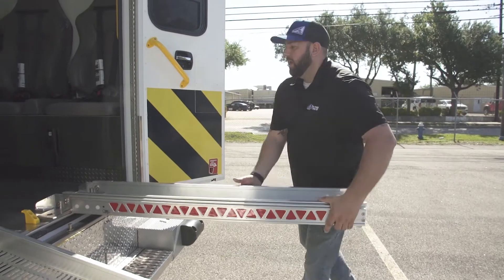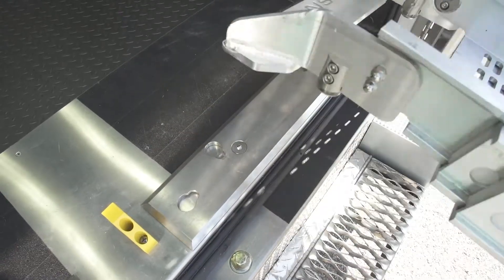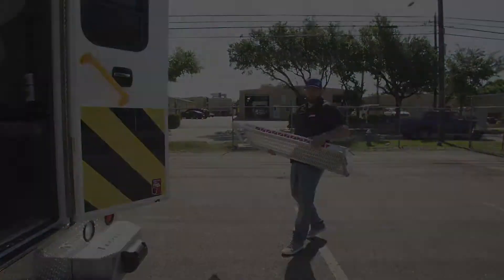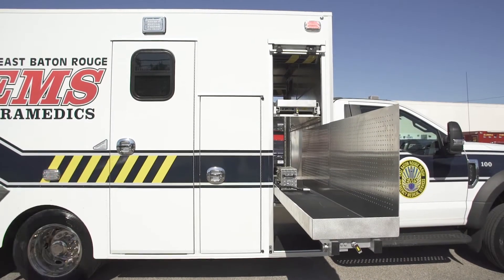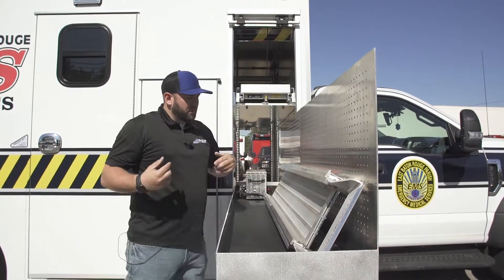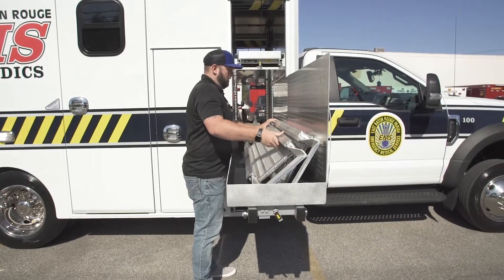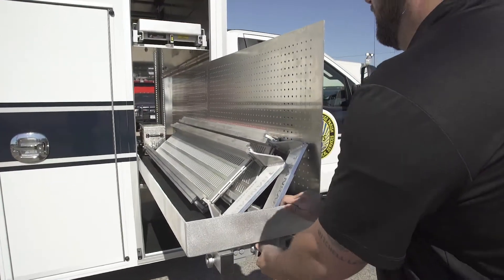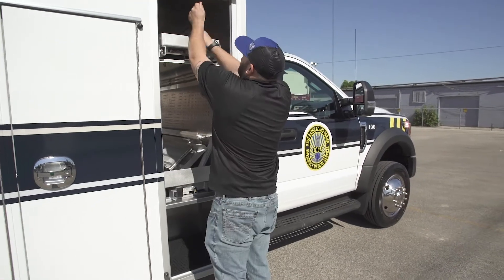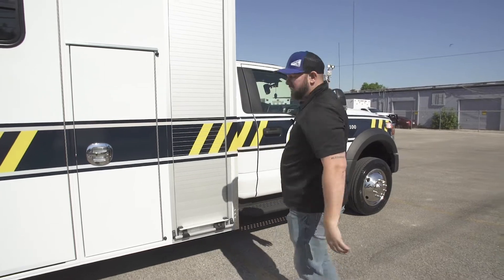Make sure your hands are clear, then push it forward, wiggle it loose, lift it up, and walk it over to the tray. With the slide extended, it makes it really easy to store these. Set them into place and repeat the process for the second ramp. Then slide it back into place — it'll lock back in — pull your shirring, close your door, and you're good to go.